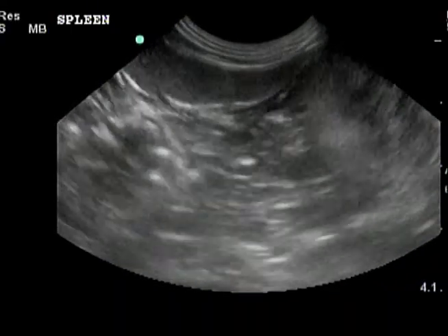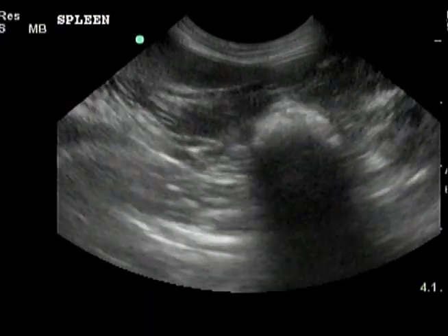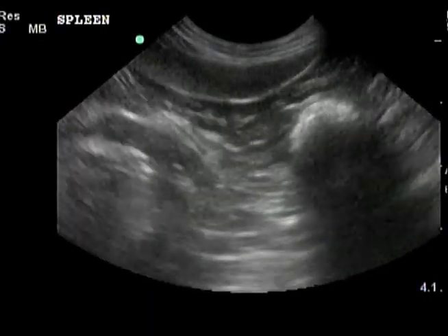Near the end of the video, the left limb of the pancreas is located between the caudal wall of the stomach and the transverse colon.